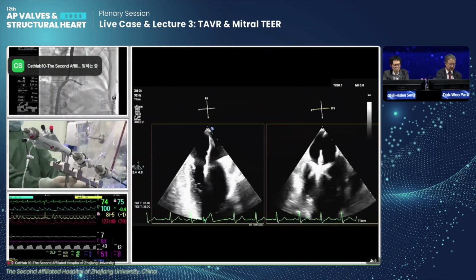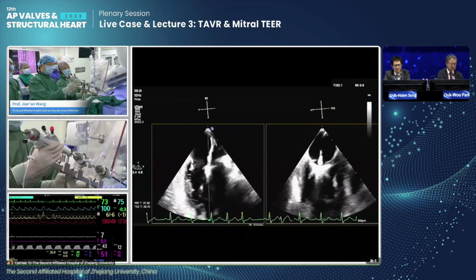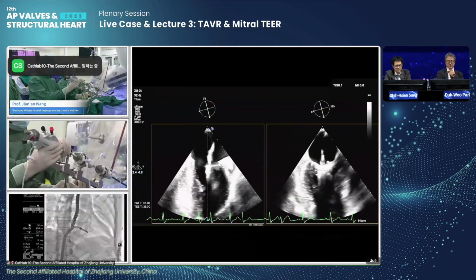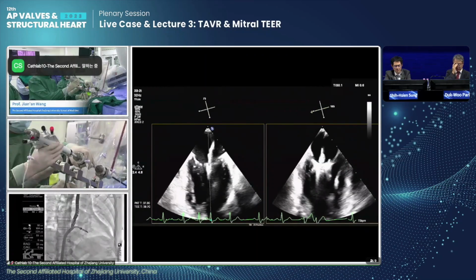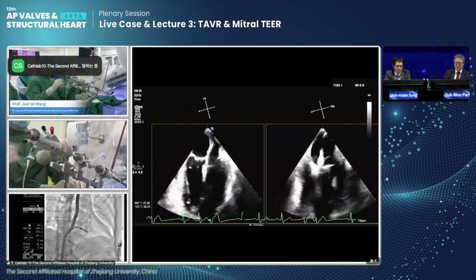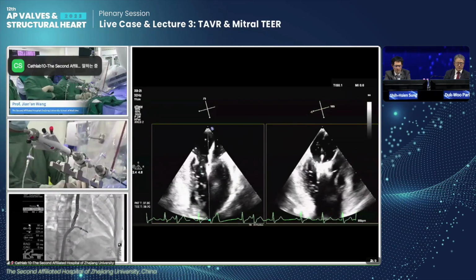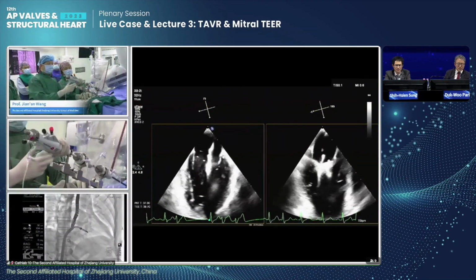往里面推一点点。Maybe just push your system in a little. Slightly medial dive. 我已经前面掉出来，差不多了。这个是后叶是吧？Yes. 后面没夹住。We don't have the correct angle for the clip.